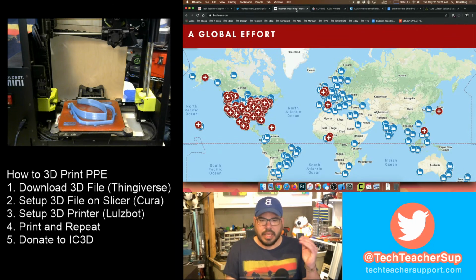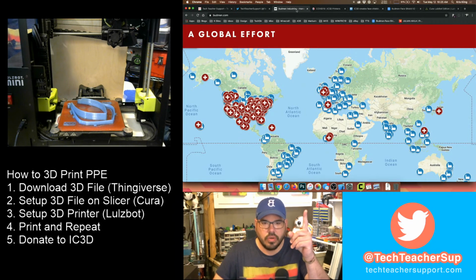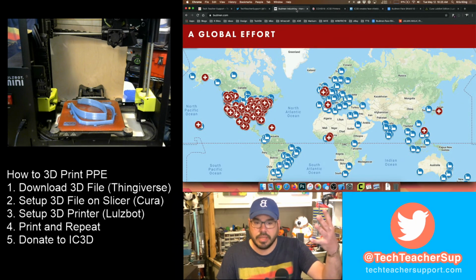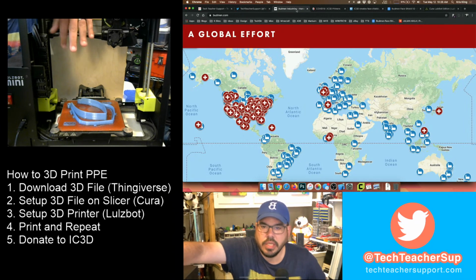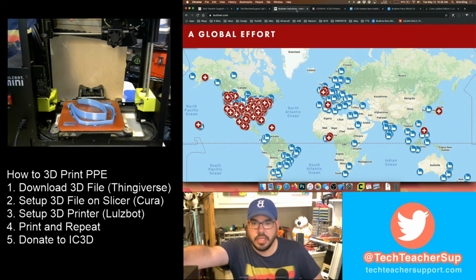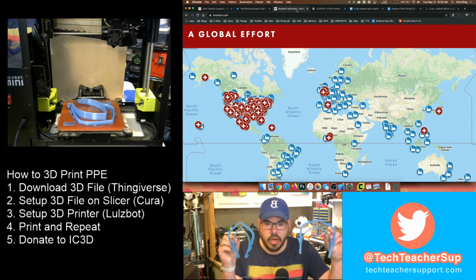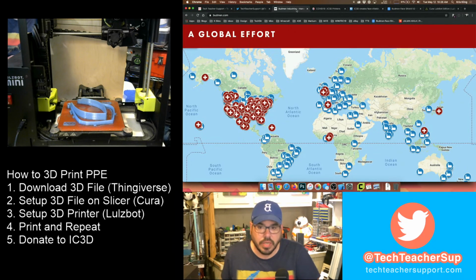So to get right into it, what we are doing today is 3D printing personal protective equipment. And if you look at the screen above me, I'm going to go over sort of the impetus and where this came from. And then, of course, up here, you see our 3D printer that has finished printing last night's face shield. I also have a couple other ones that we 3D printed, so we'll talk about these. We'll remove that one, and we'll start another one.